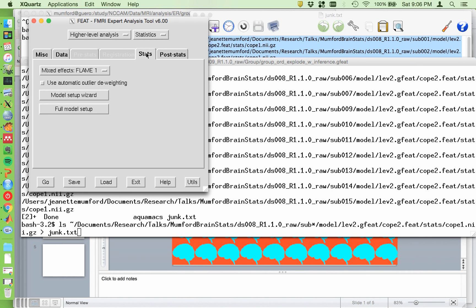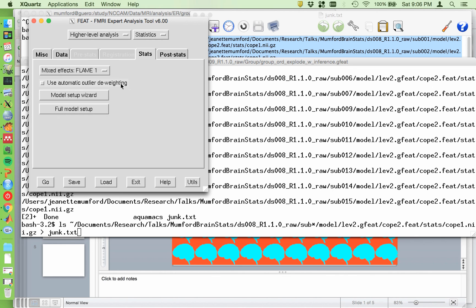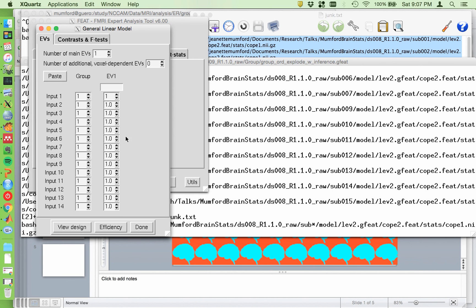Okay, the only other, well, there's two more tabs, the stats tab. Now we're going to use Flame 1 because we're at the highest level. You can try the outlier de-weighting. I find it takes a really long time. And it doesn't typically make a huge difference, but sometimes it can. But it adds a considerable amount of time to your results. So yeah, take that into consideration.